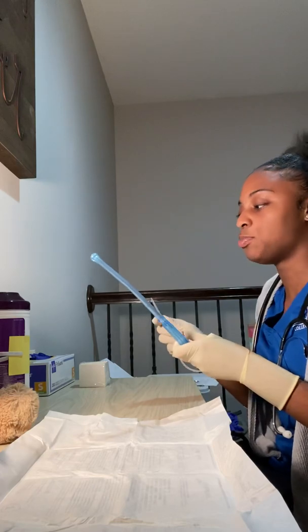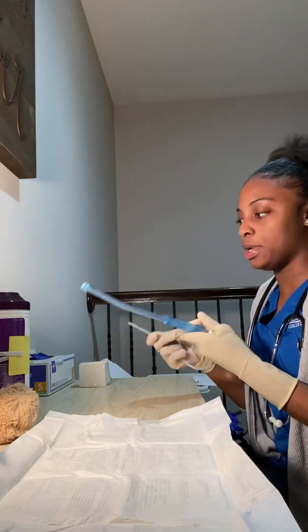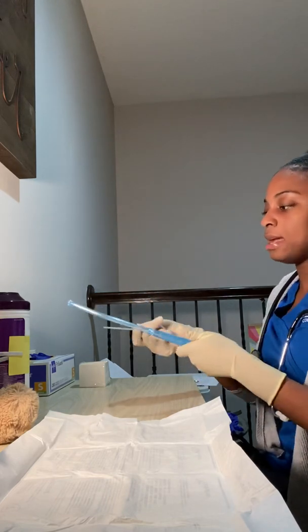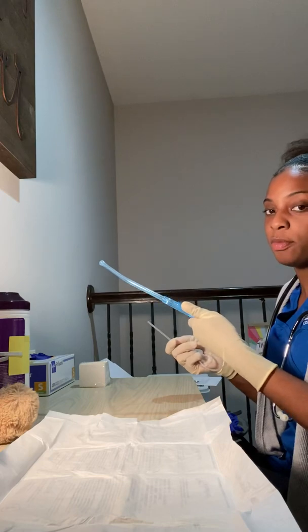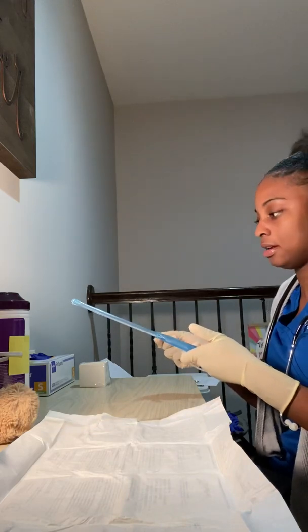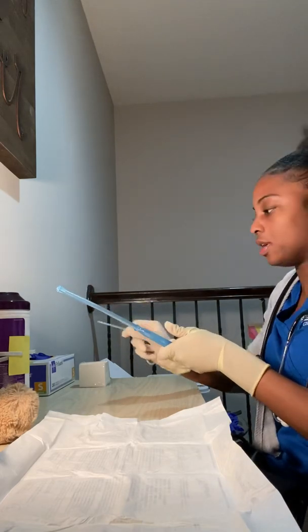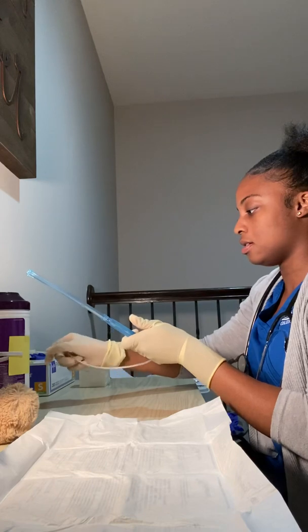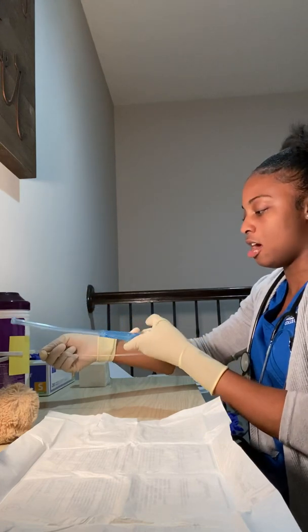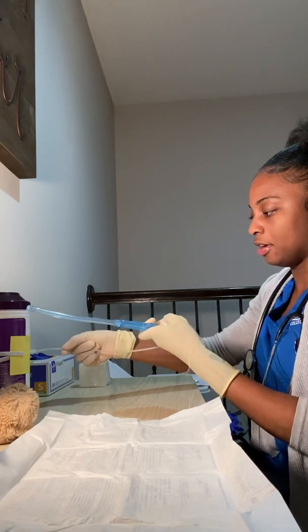Okay, so I've hyperoxygenated my patient. My patient's gonna be on continuous pulse ox throughout this procedure so that we can monitor her O2 sats as we're doing it, so we can know whether or not we need to continue suctioning and whether we need to go ahead and oxygenate her some more. So I'm gonna go ahead and start. As I'm inserting into my patient's trach, my hand is off of the port. I will put my hand on and twist and alternate on my way out once my patient has begun coughing. So I'm gonna go ahead and insert. My patient is sitting up in a high semi-Fowler's position as well. So I'm gonna go ahead and insert the catheter. My patient began to cough, so this usually takes about 10 seconds. I'm going to go ahead and pull my catheter out.